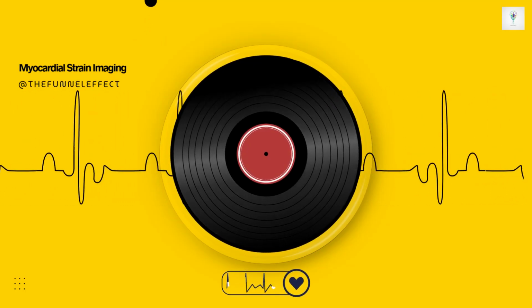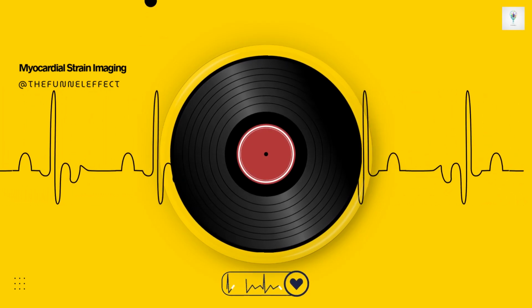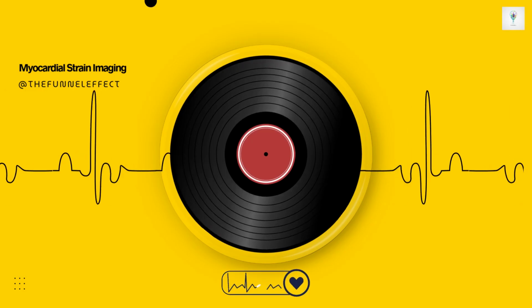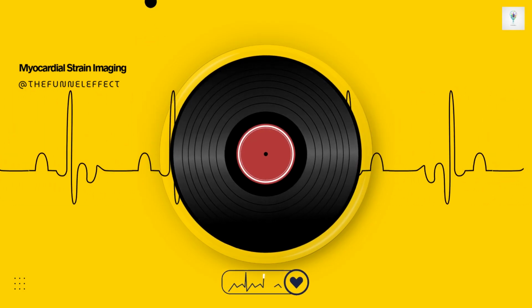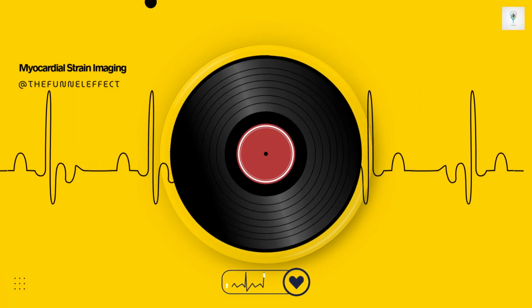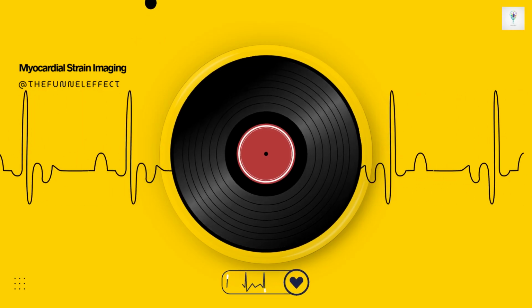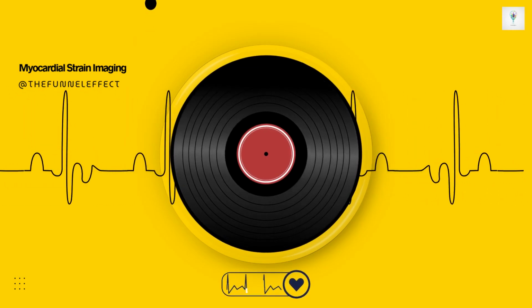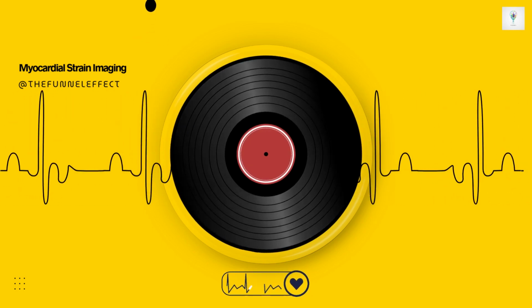When we apply it to the myocardium, we're essentially quantifying how much the tissue itself shortens or thickens during contraction and relaxation. And the key thing is, it's not the absolute length we care about, but the relative change, right, as a percentage. Precisely. In cardiac imaging, we overwhelmingly use what's called the Lagrangian strain description. The calculation itself is quite simple. It's just the change in length divided by the reference length, expressed as a percentage.